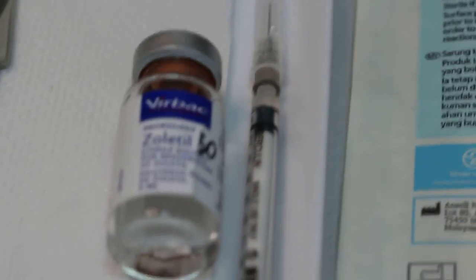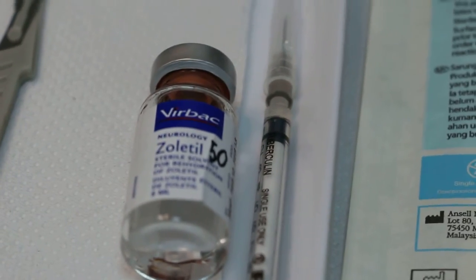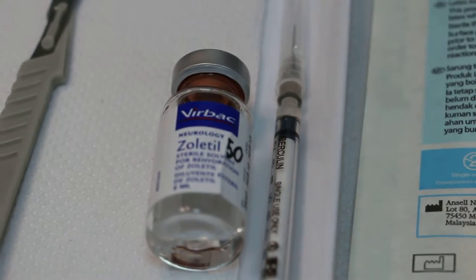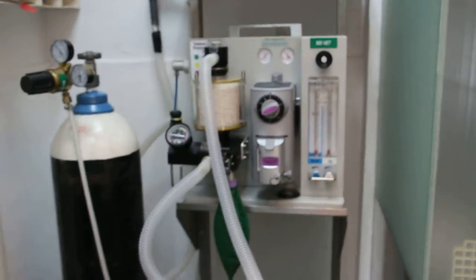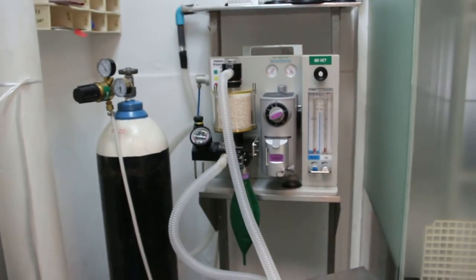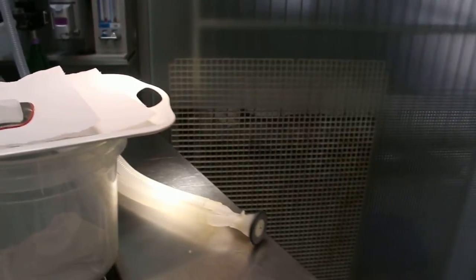And if it's not sufficient then we will supplement with isoflurane gas. Isoflurane gas and oxygen through the mask here.